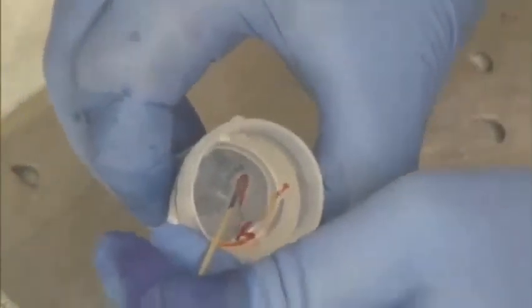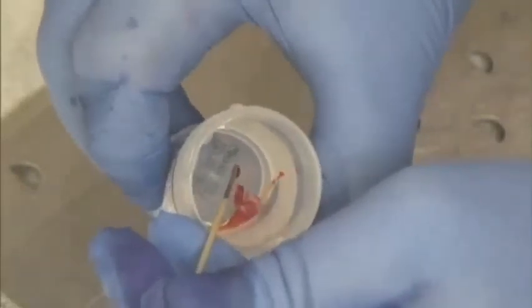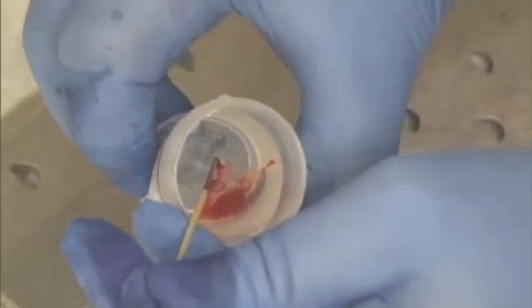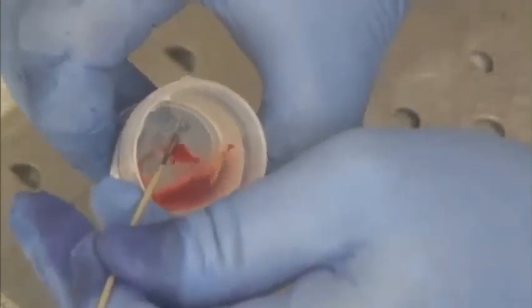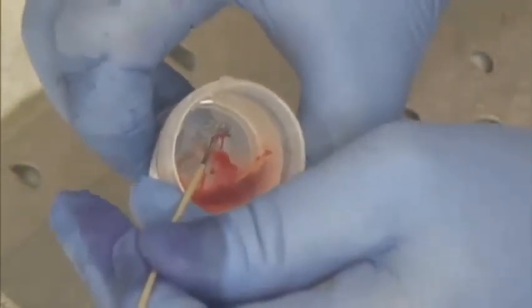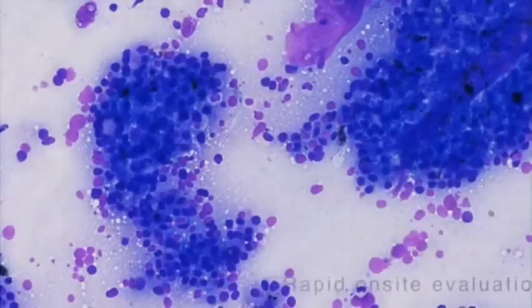As we see, long core tissue was visualized. Rapid on-site evaluation revealed malignant cells, which was confirmed to be hepatocellular carcinoma on cell block.